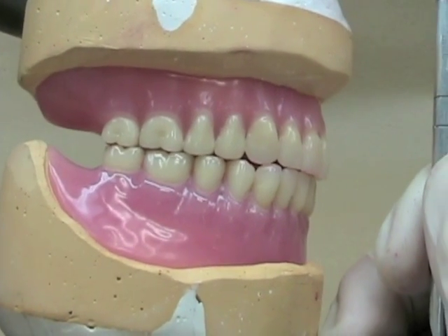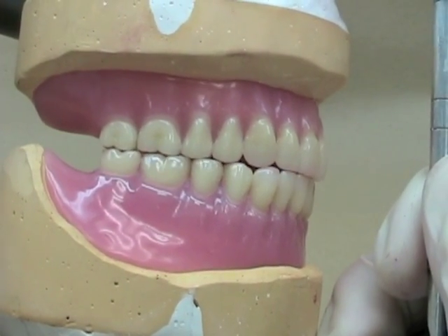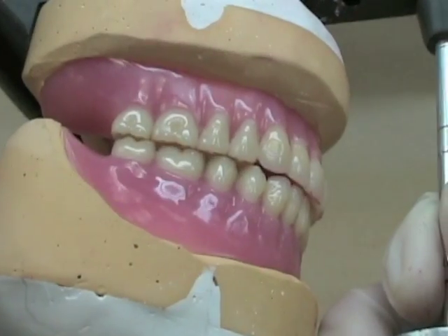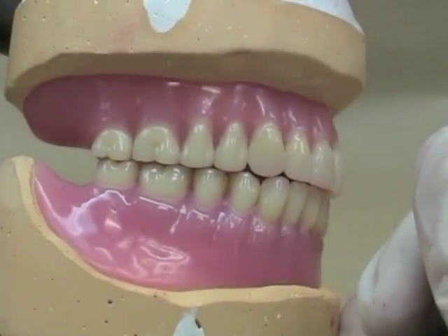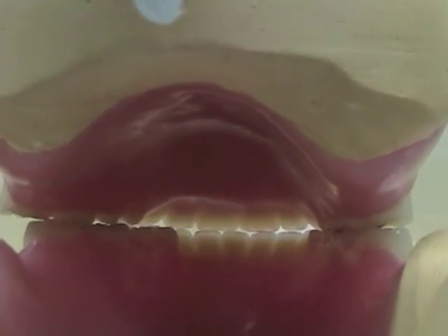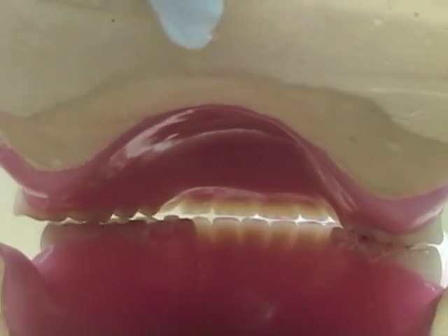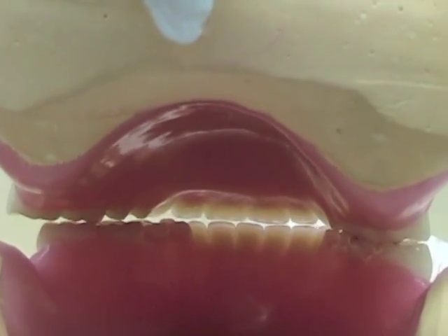When the patient goes into an excursion, the anterior teeth should not preclude contact of the posterior teeth. You can see here from a lingual view that we're keeping contacts on both sides of the arch as we move into excursions.